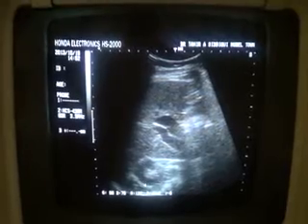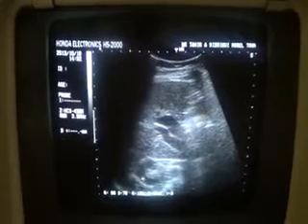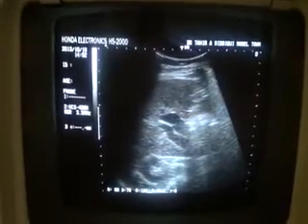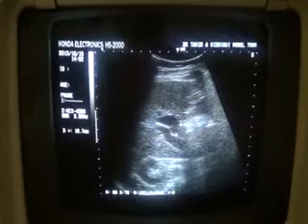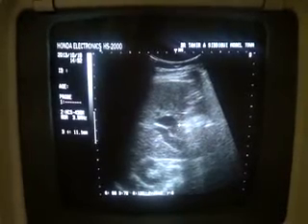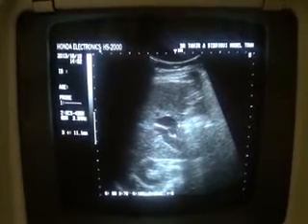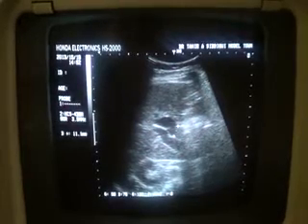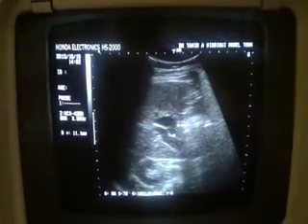This is the right kidney in transverse section and this is the liver. These parameters are within normal limits except the common bile duct, which is dilated up to 11.1 millimeters, and there is no history of surgical intervention. Anything above 7 millimeters will be considered abnormal, so a dilated common bile duct is seen in this view.